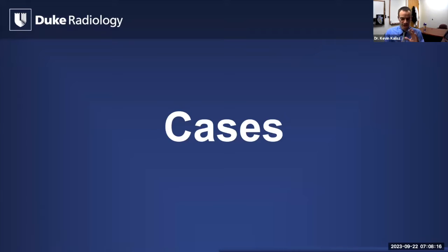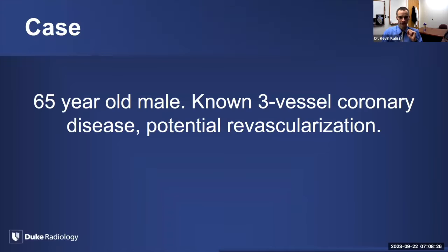I could spend multiple hours going over those in more depth, but I think it's more illustrative to go over cases, and they will reinforce the sequences and let us see some cool pathologies. So I'll have a little bit of a clinical vignette, and then based on this vignette, how I would approach the study and what protocols, so to say, I would use, and then we'll go into the key findings.